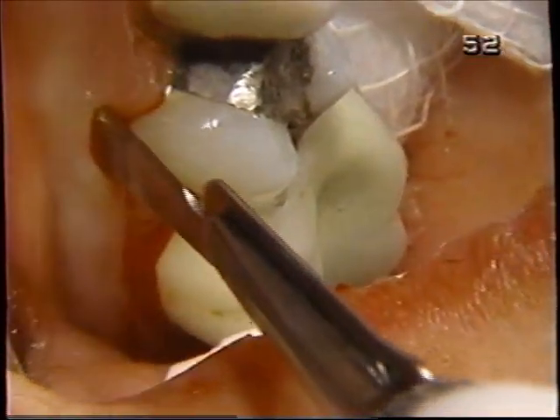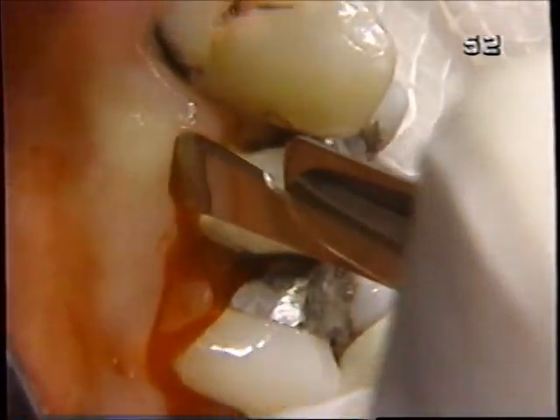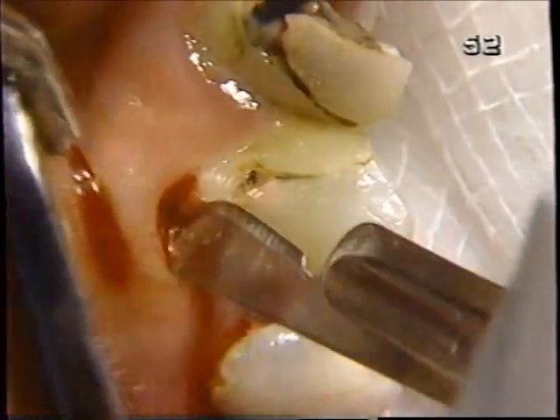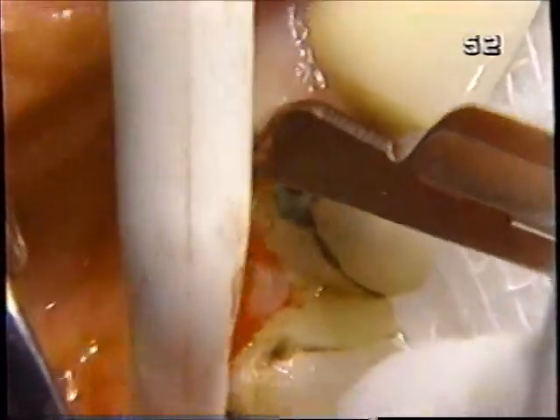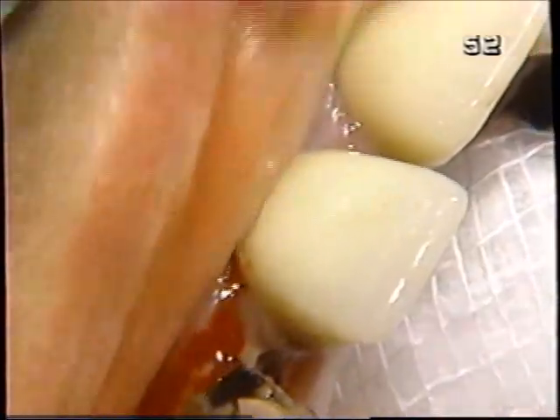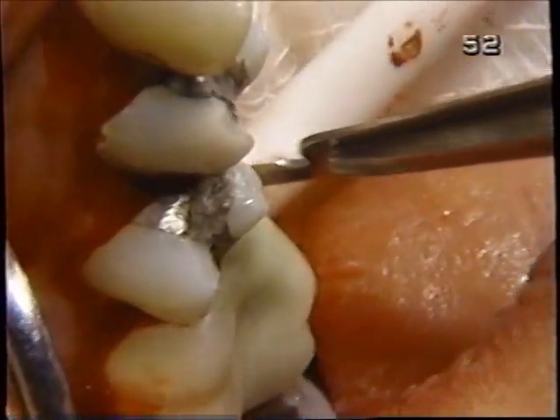So we're starting on the right side, and we have a bite block on the left side to help support the TMJ. That really goes a long way to lessen problems with the joint. So we'll work up to about the midline. It looks like we may do a frenectomy in the process here. We'll do the same thing that we just did on the facial, on the lingual aspect now. Let's go now with the 301.